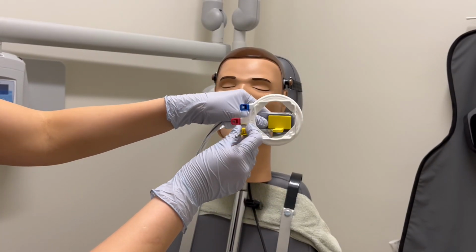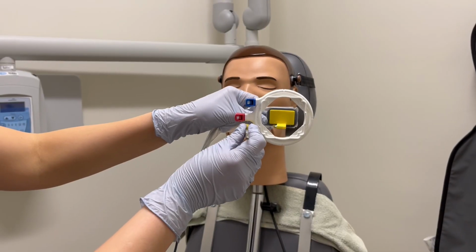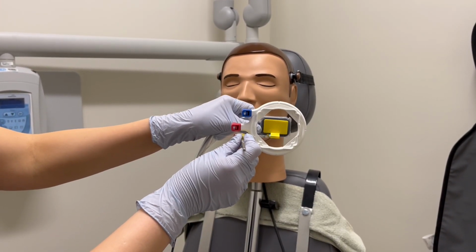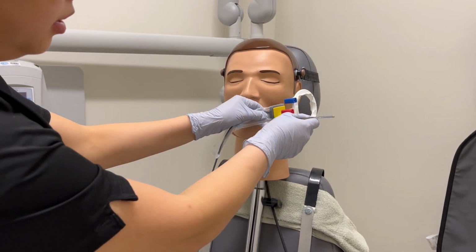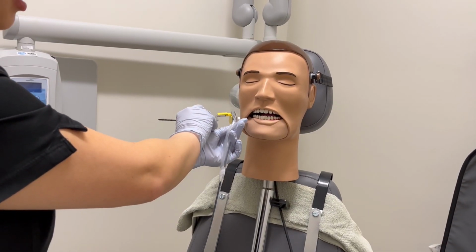I'm going to flip this the other way. This will be the correct orientation and assembly of the RINN for the upper left posterior PAs, including the lower right posterior PAs.